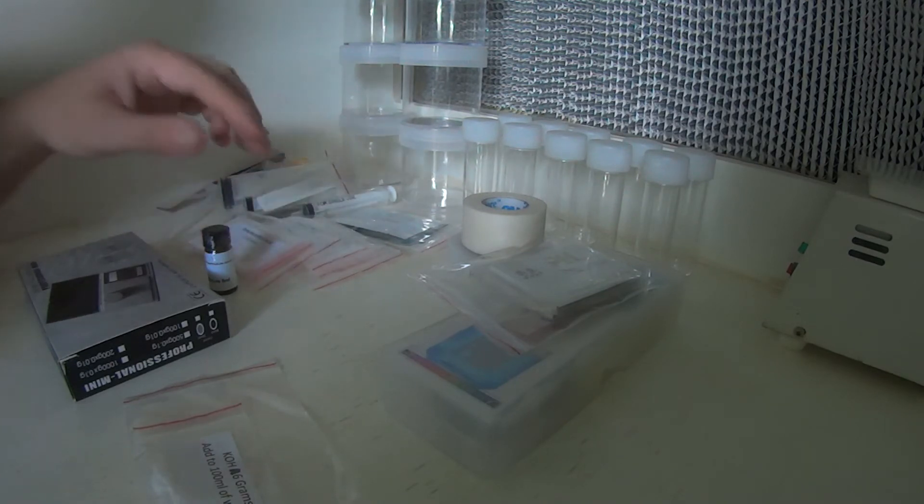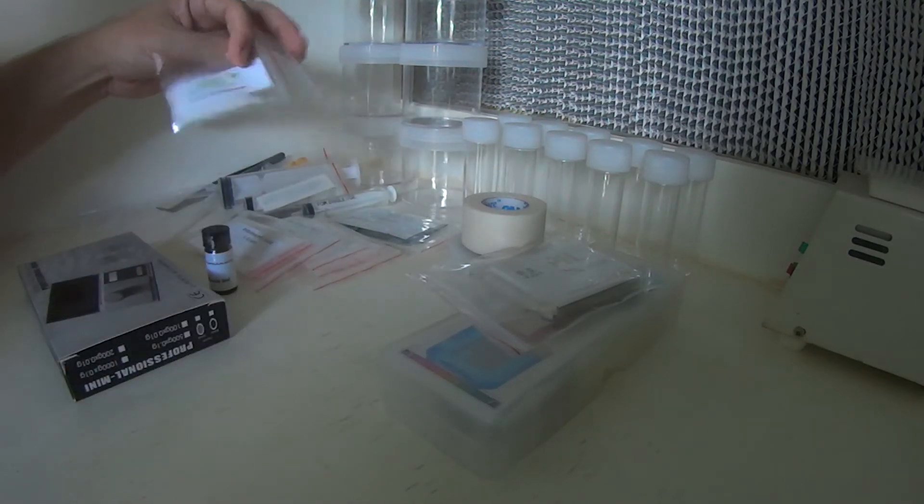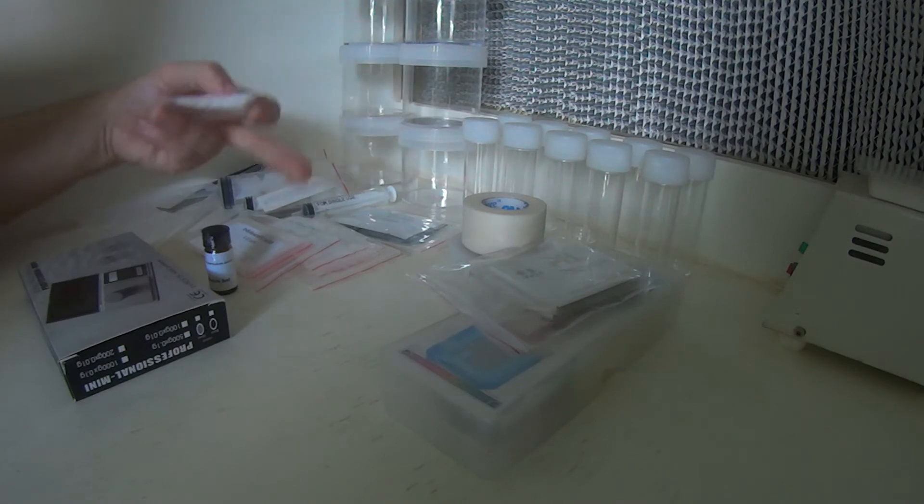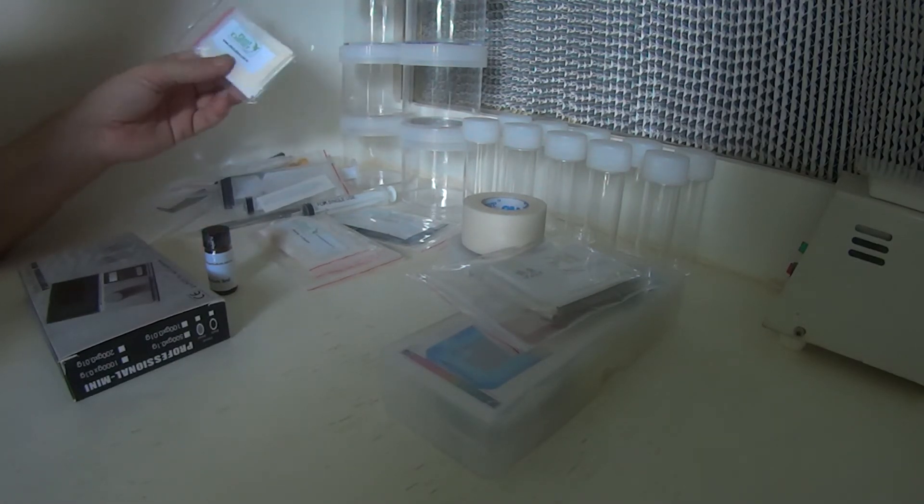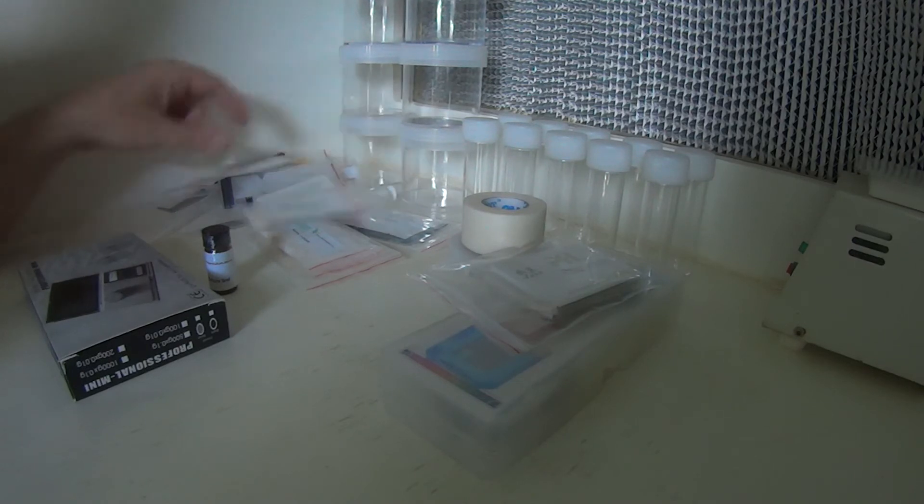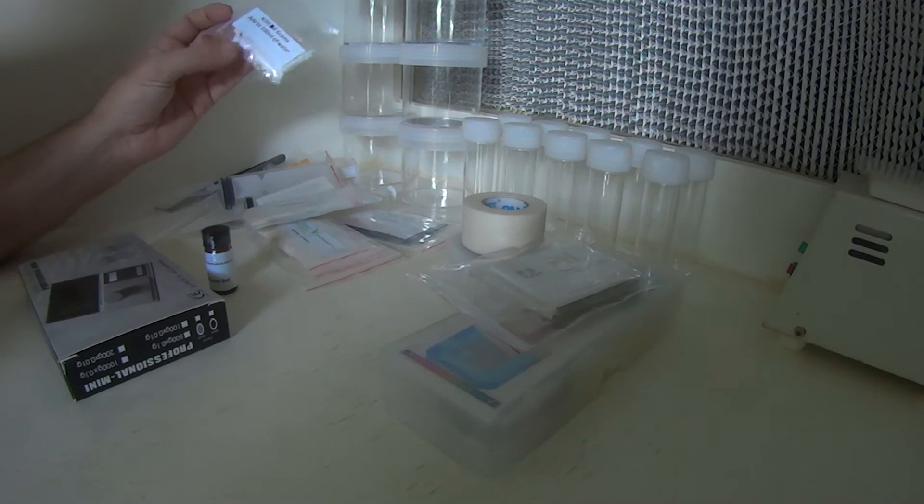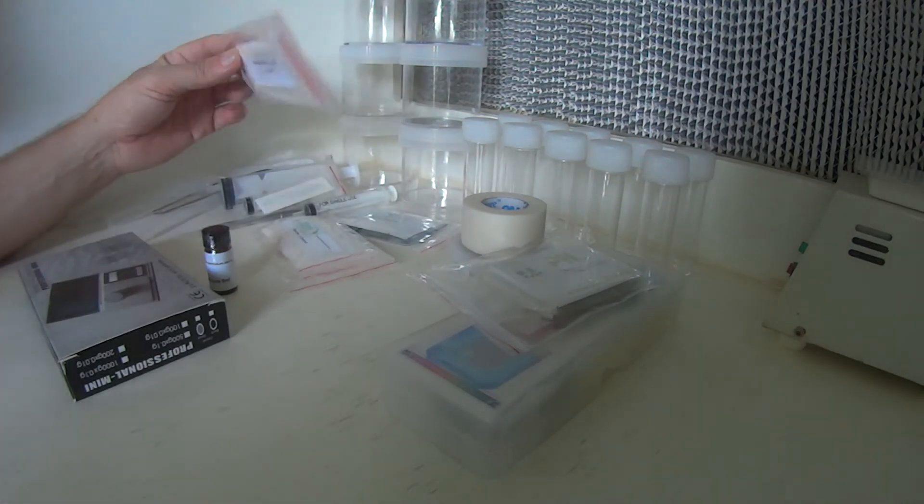And also some KOH. This is what we use to dissolve our plant growth regulators. Most plant growth regulators are not water-soluble, so they require a base or an acid to dissolve them. Simply add the contents of this packet to 100ml of water, and that solution is what you use to dissolve your plant growth regulators.